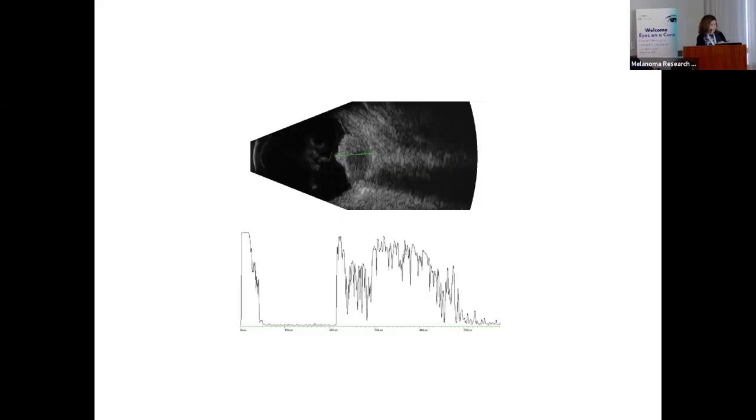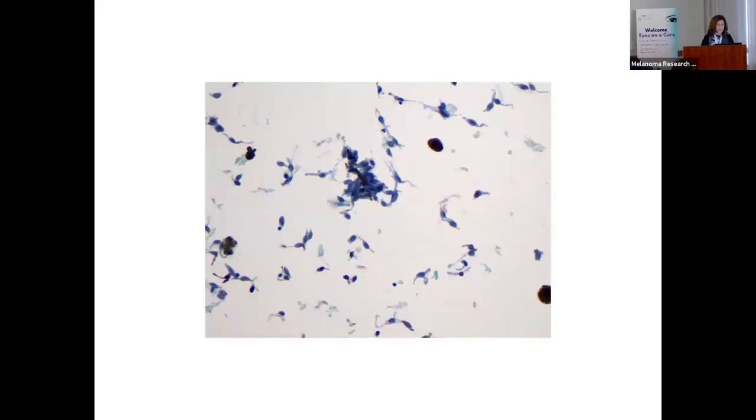And this is an imaging study to basically show you the tumor right here, a relatively large tumor. And this is what this tumor looked like on the slide. It had our spindled cells even at this magnification. Now, you all will be able to make this diagnosis now. Spindled cells and pigment.